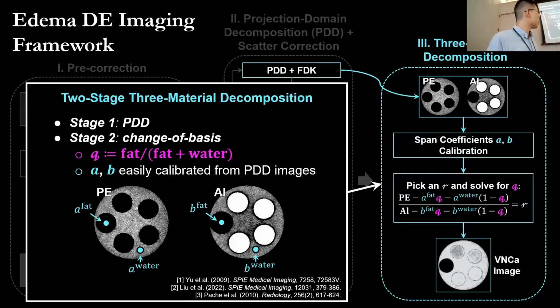Another thing is there's an R term on the very right side of this equation. This is related to the bone coefficients. Normally, it's a knob that we can slide to adjust the value of R that we want to use to make the image look slightly better. But here we fix the constant R for all our studies.